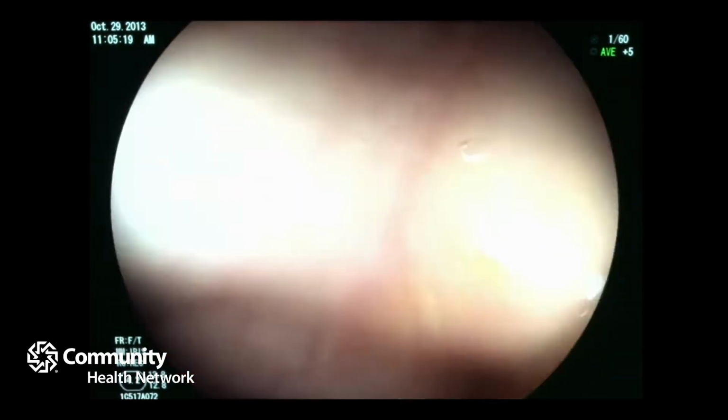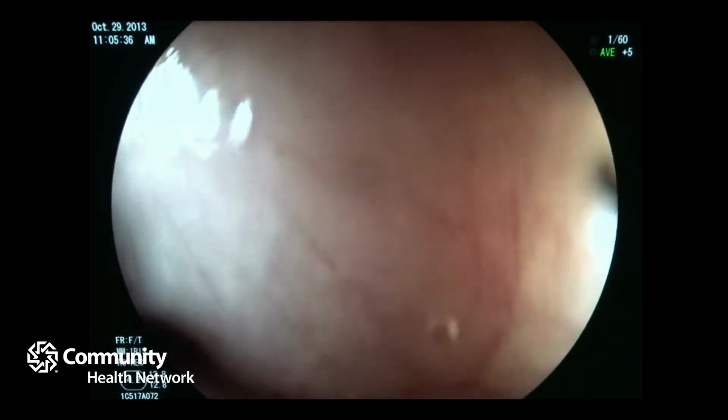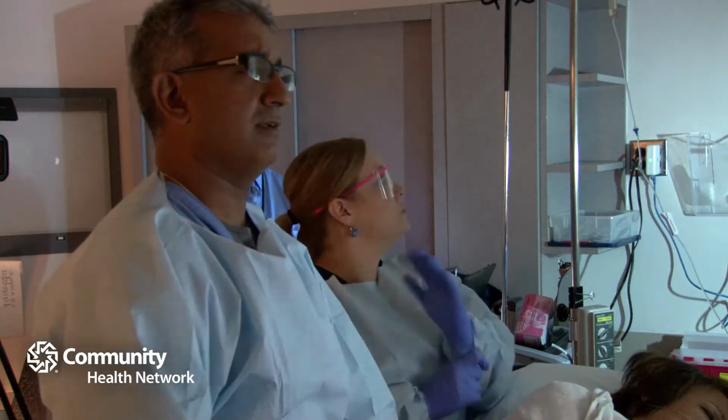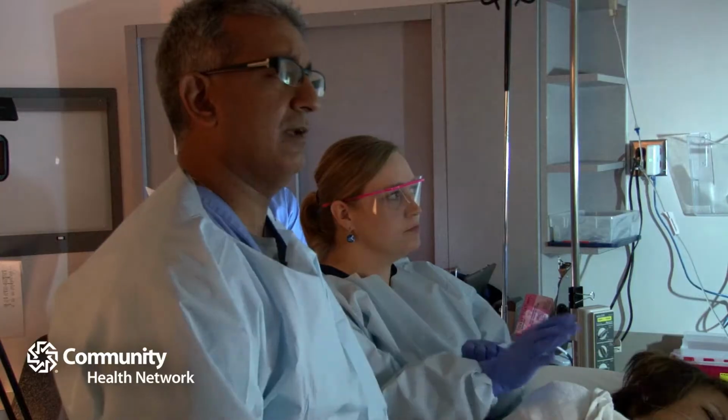The prep, how much does the colon turn and flip on itself? Has a woman had a hysterectomy before? Have they had surgery before? We find all these things affect how the colonoscopy goes and how accurate it is. But the prep is probably the most important part of it. So I use a little bit of water sometimes just to guide myself as you get little angles that you have to work around.